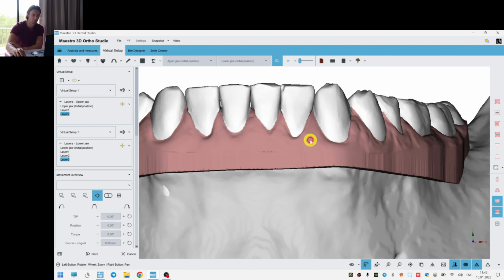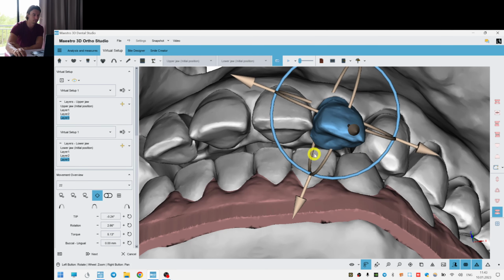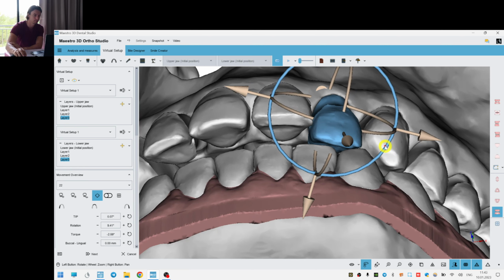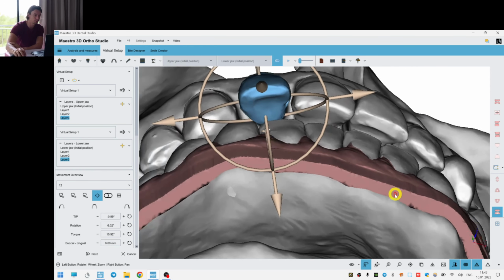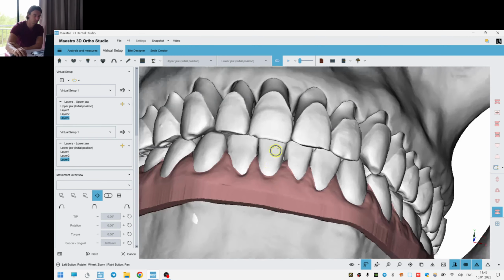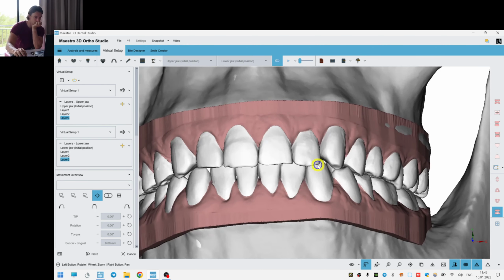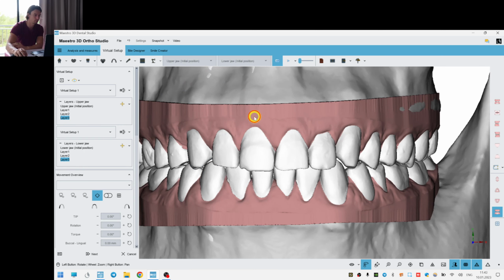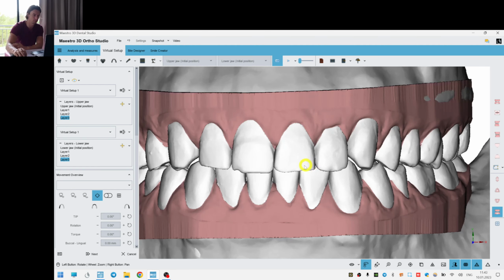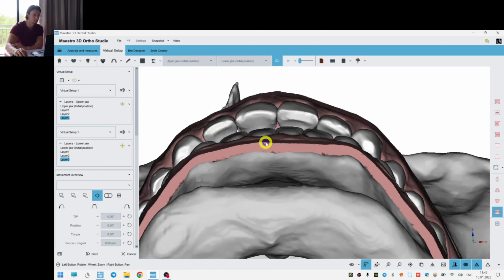So now let's create the layer 3 for the upper teeth and recline them. I would recommend veneers for this guy. Okay, let's turn the gingiva on. You can add some more palatal tipping to the canines. Of course, I would like to improve the torque, but it's not possible with this length of the roots. So we are very limited here.